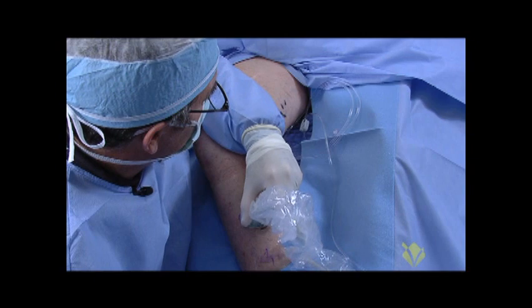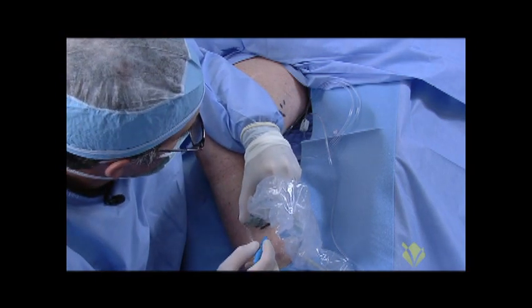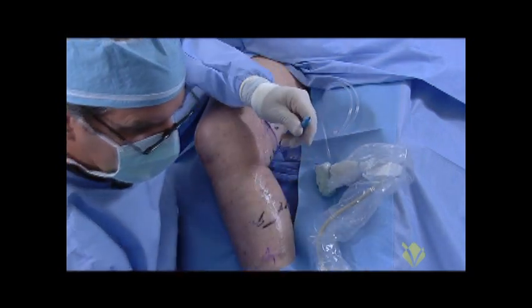You can see that again — that's in the mid-calf. And finally, down in the lower calf, there's a very superficial vein up there which is residual greater saphenous vein that I think is coming off of this perforator. So rather than go after some residual GSV — your great saphenous vein — I'm going to focus on this second perforator down here as well. That should be fairly straightforward to cannulate. Keep your eye on that one because we'll be getting that one also.